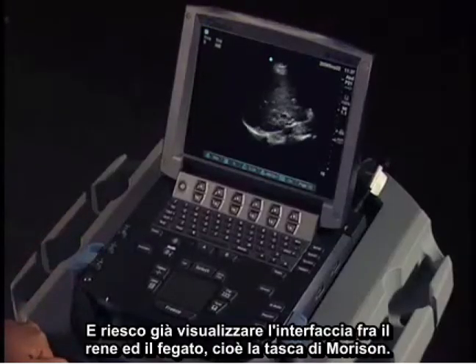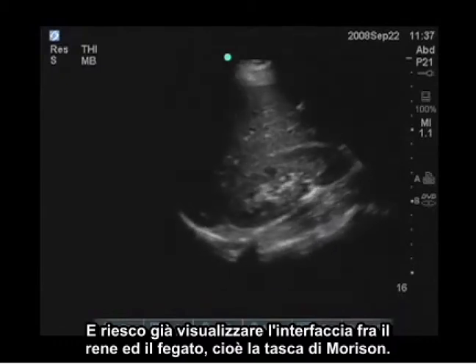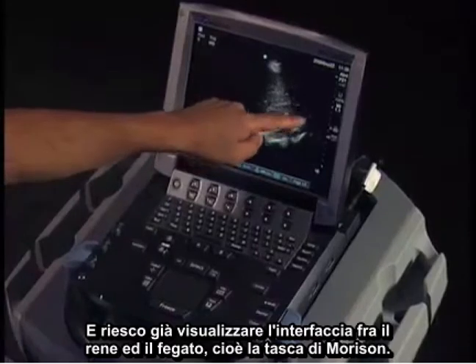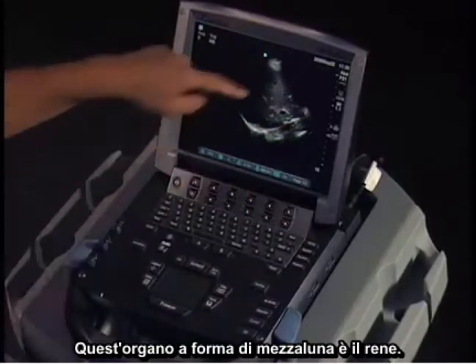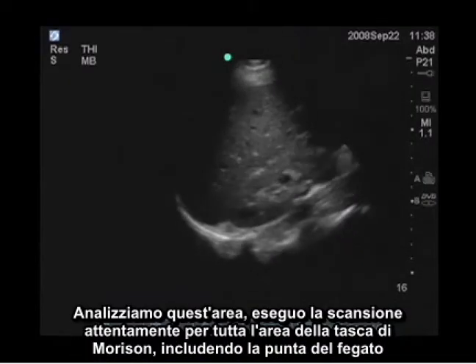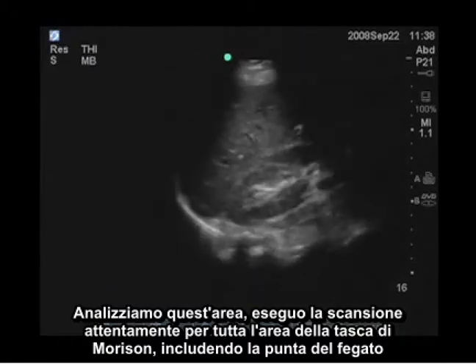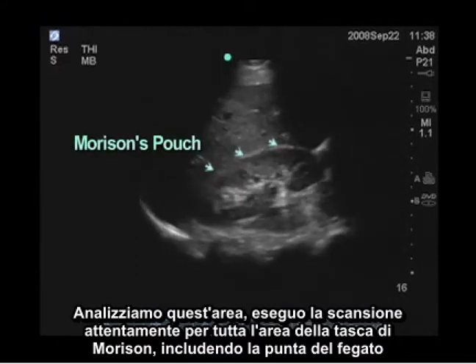I'm just adjusting my gain here. Already I can see the interface between the kidney and the liver, which is Morrison's pouch. On the bottom, this crescent-shaped organ is the kidney; above it we see the liver, and just to the left side of the screen we see the diaphragm. I'm going to carefully scan through the entire area of Morrison's pouch, including at the liver tip.